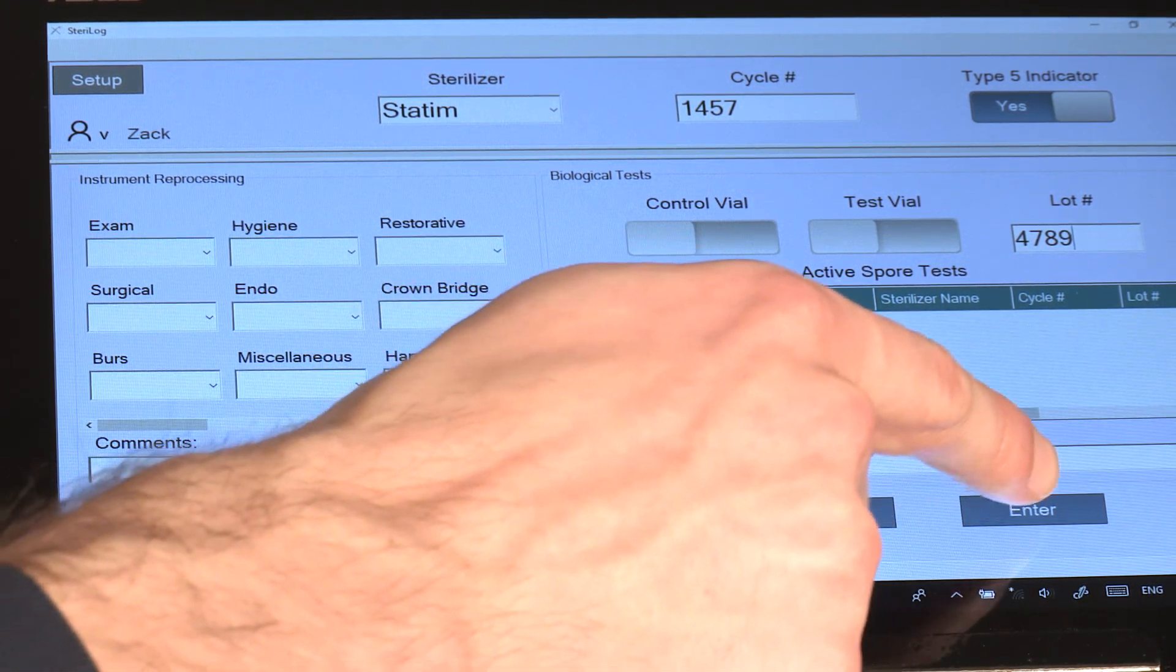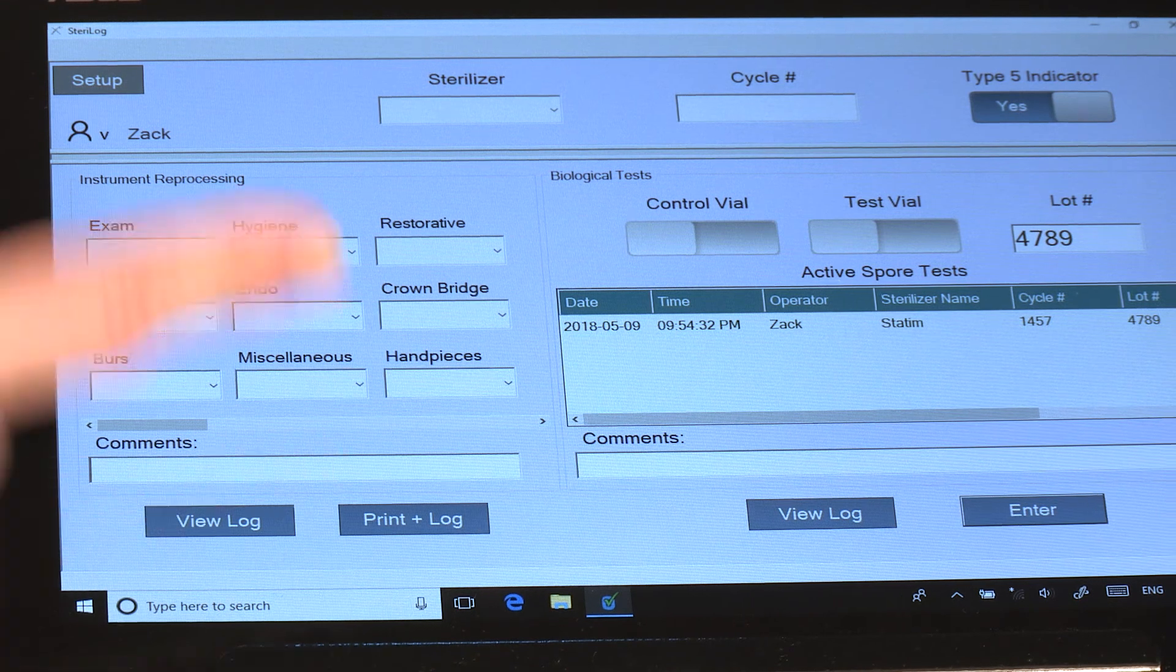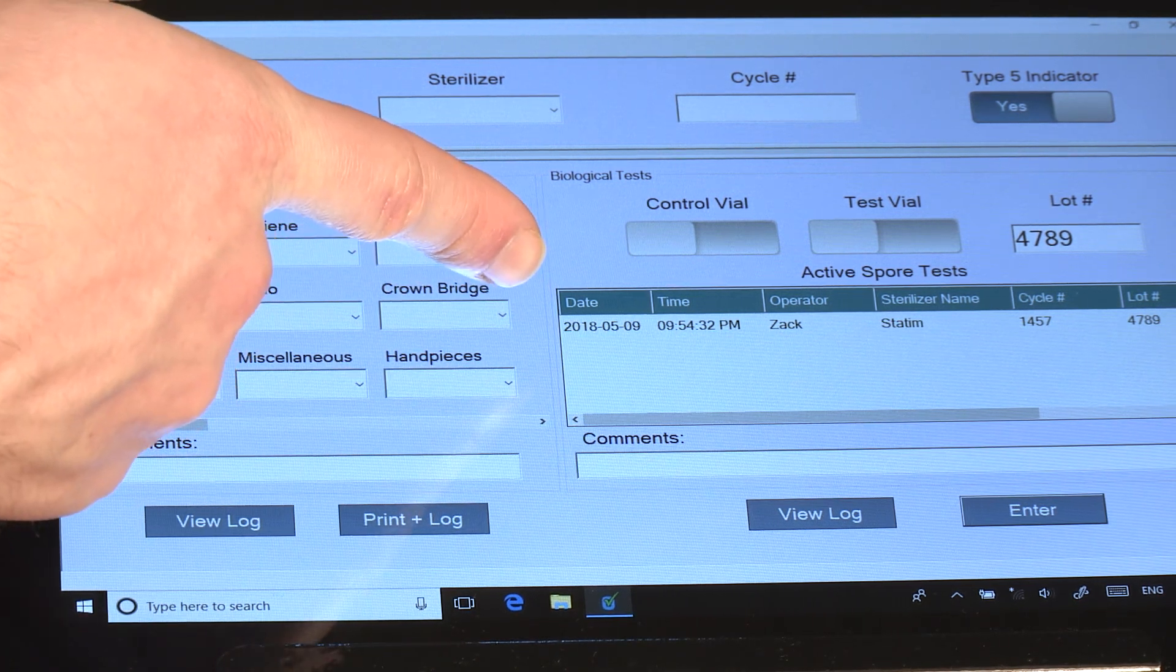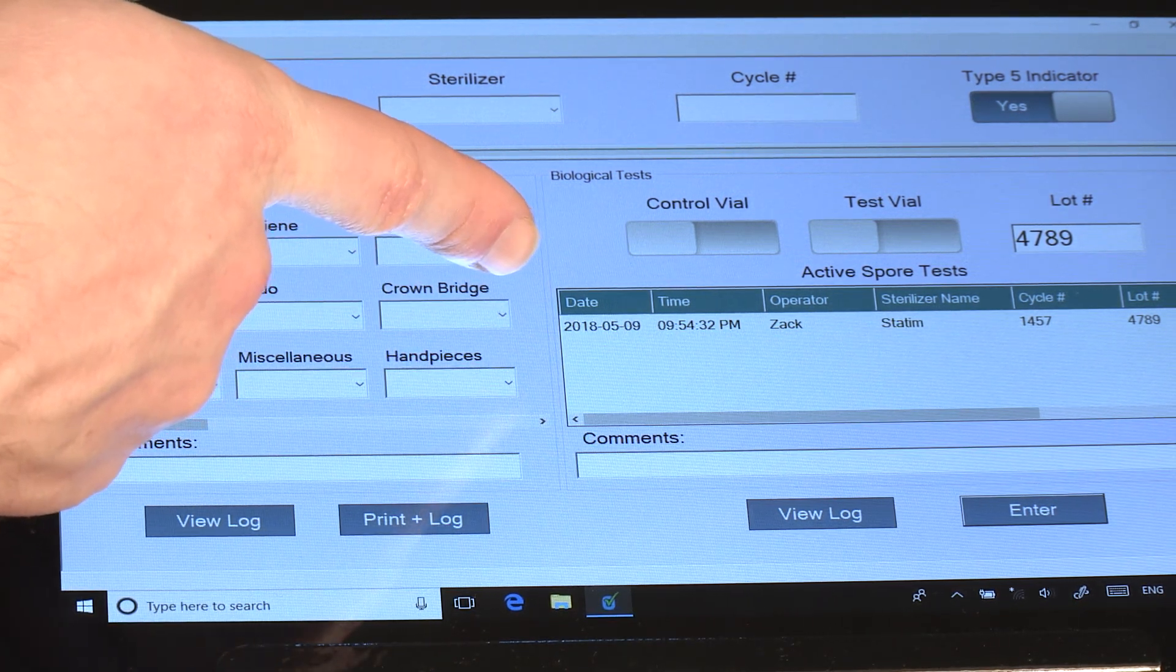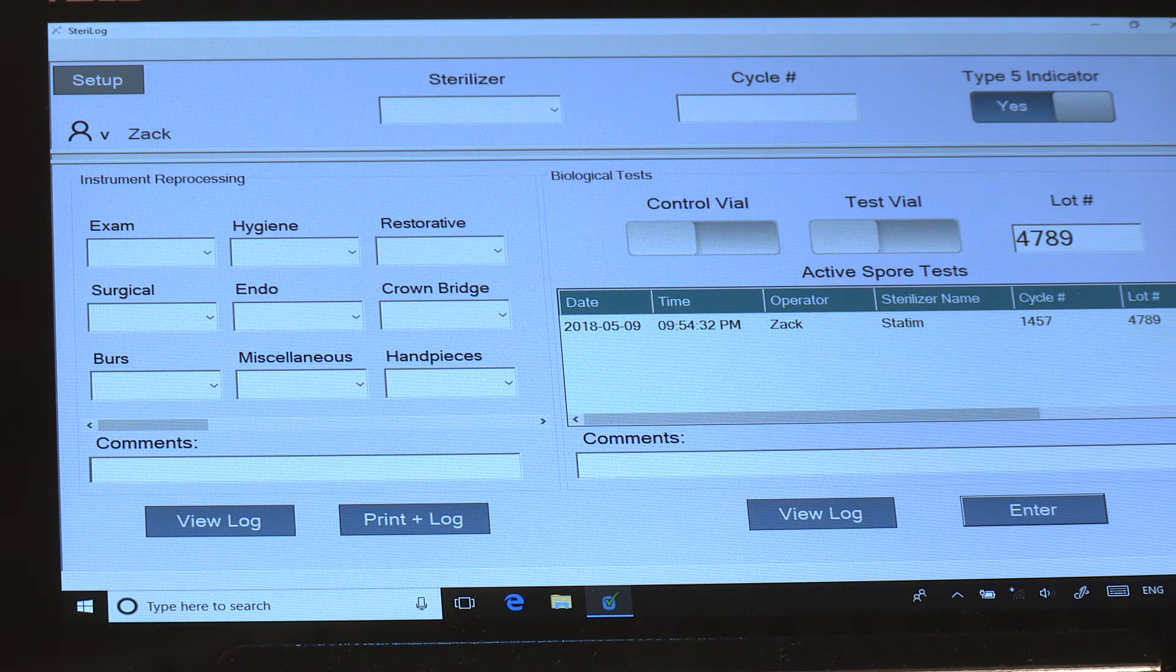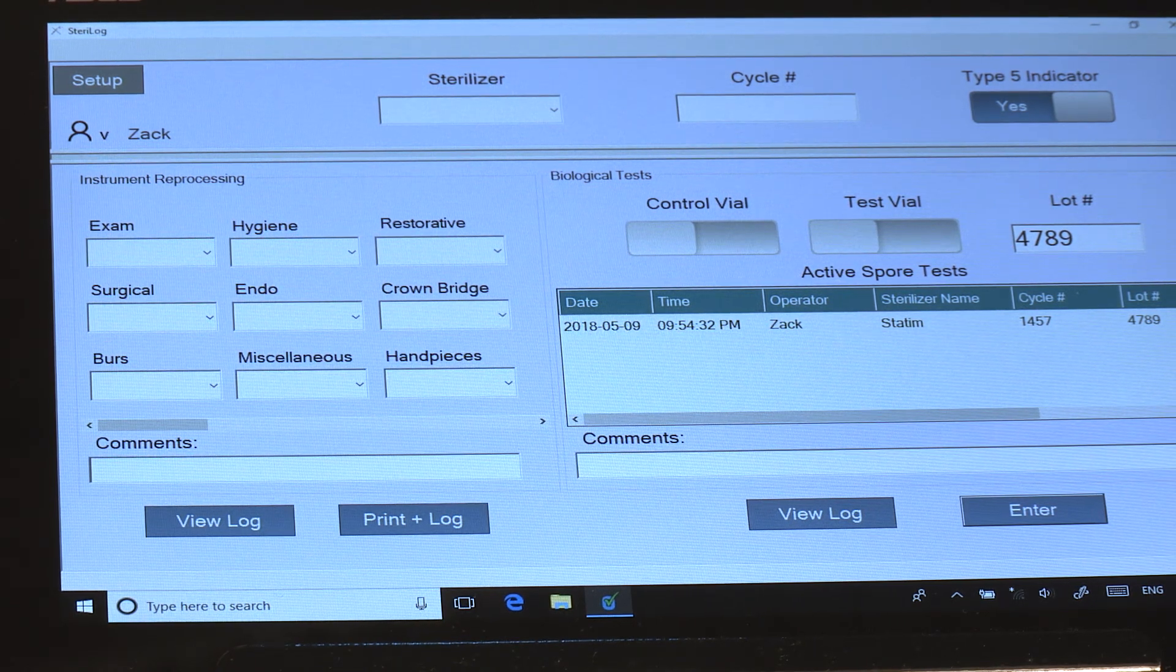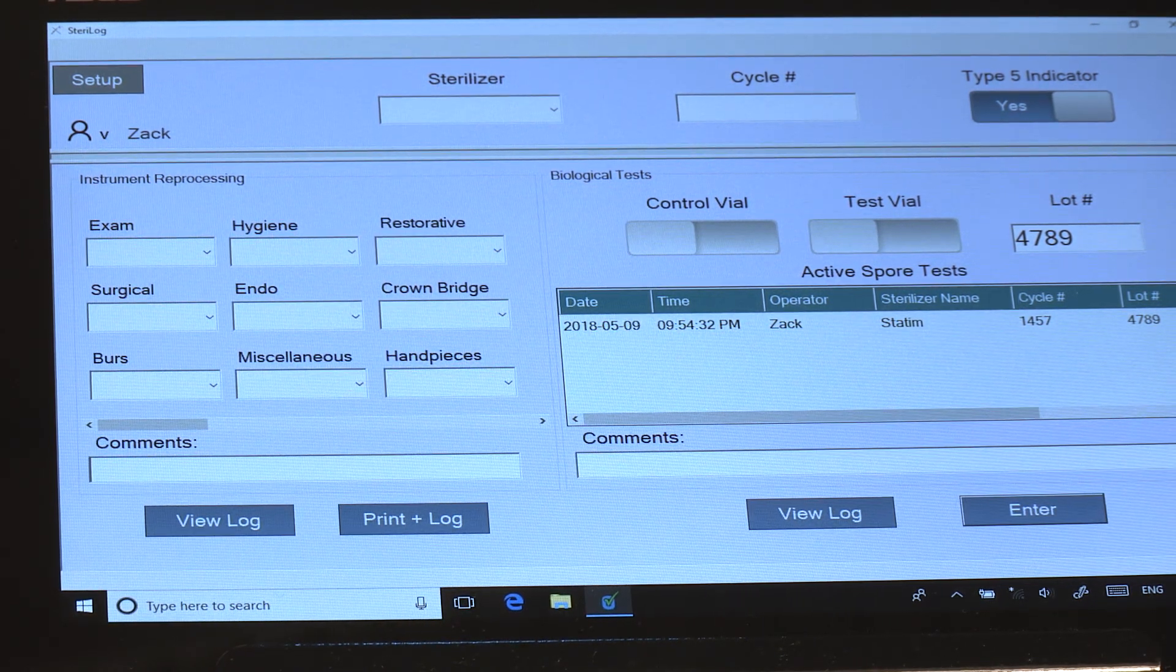This lot number will be retained until the user updates it after they complete their box of biological indicators. You would then hit Enter and notice that the spore test has now been added to this Active Spore Test Log.